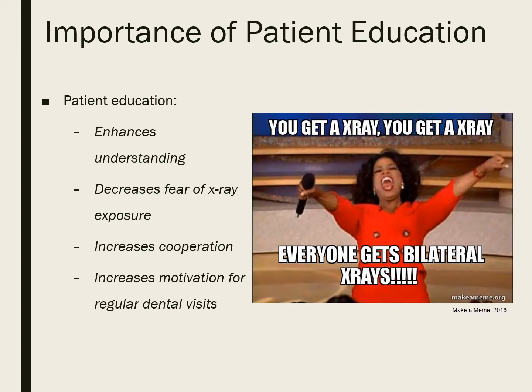All right, and in that patient education, we need to help the patient understand. We're going to enhance their understanding of those dental images and of X radiation and how we use it. It's going to decrease their fear of X-ray exposure. Some patients will show up to your office that honestly think that X radiation could cause cancer or could do these terrible things, and they don't realize that the amount that they're getting from a dental X-ray is actually much lower than what they may think.